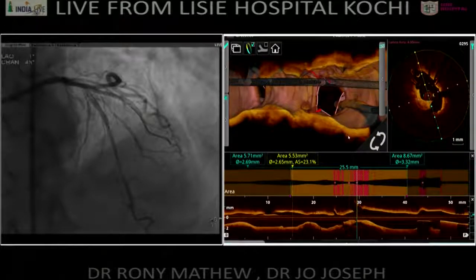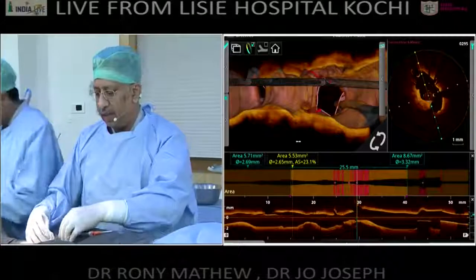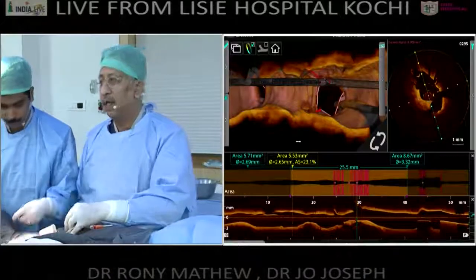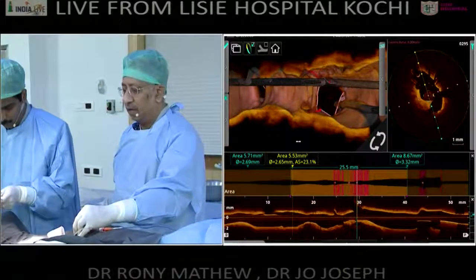So what I'm going to do now is I'm going to crush it. So you give me a 2.5 balloon on the diagonal and a 3 on the LAD. This is the LAD. This is the diagonal. Do you have any questions on this OCT and what I've done so far?